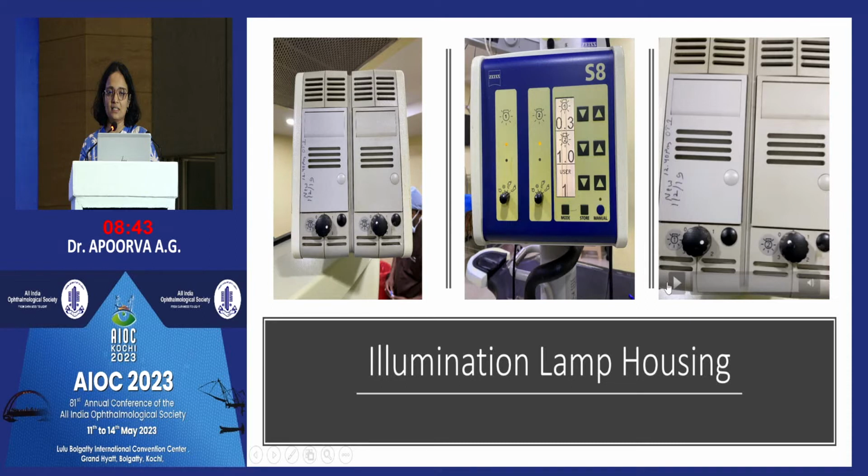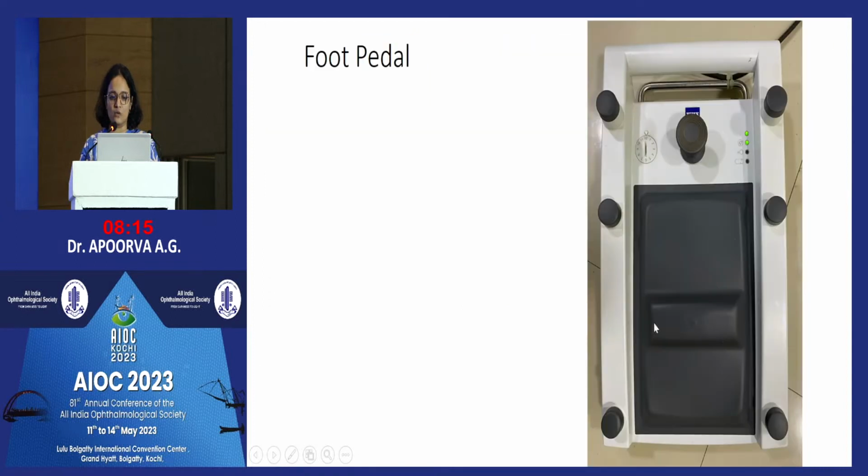When one lamp fuses, the other lamp automatically swings into action, and it is helpful to write the date on which the new lamp was put, so that we know that a new one has been placed, and we are not confused about which is the new one and the old one. So let's look at the foot pedal now. The foot pedal is also very intimidating for a novice surgeon.